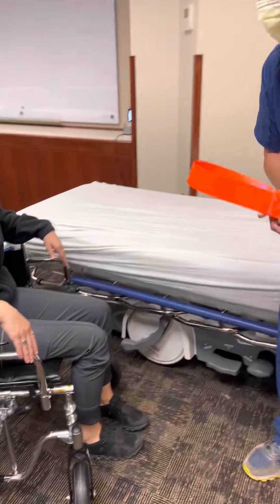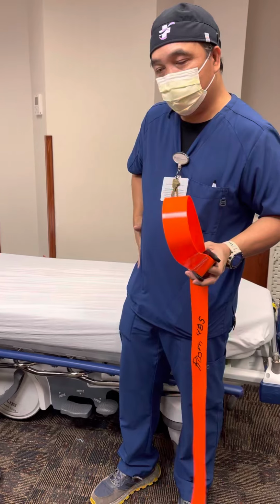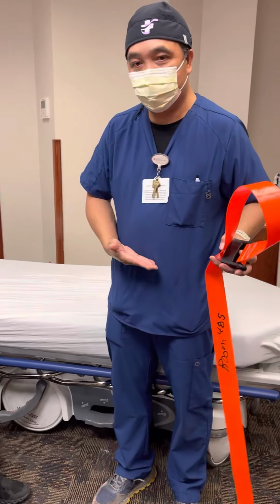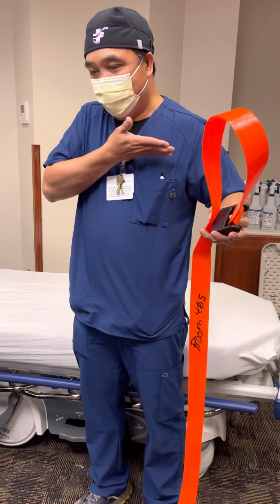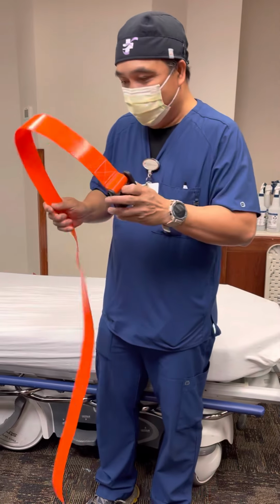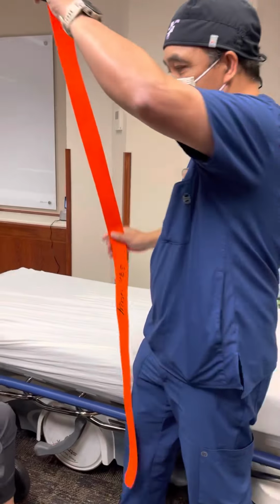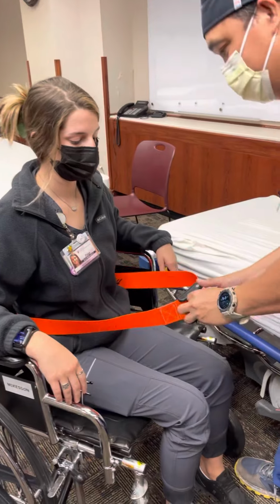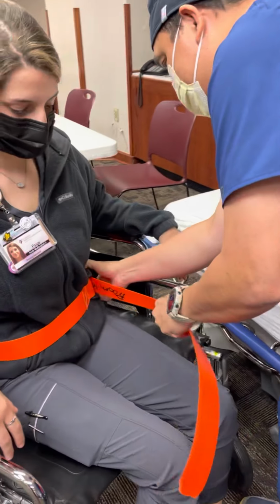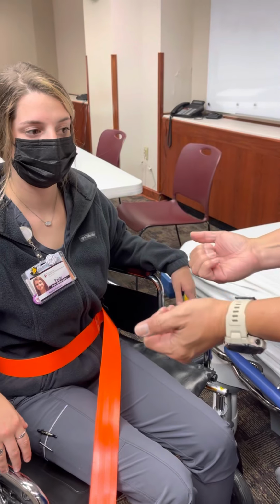So to use the gait belt, we need to make sure it's on the waist as much as possible, but you've got to watch for any incisions on the abdomen or any tubes right here, so you might have to use it above the breast. At this time, nothing's going on with her abdomen right there, so we're going to put it around the waist area. Okay, so we need to make sure it's snug but not cutting into the patient, because when the patient stands up, it might loosen up a little bit.